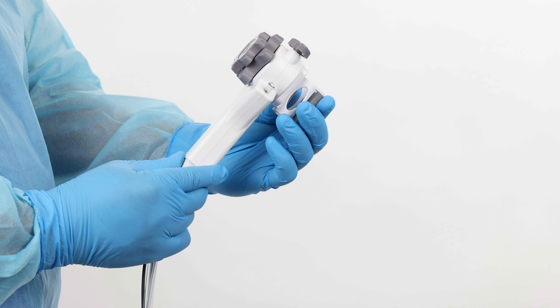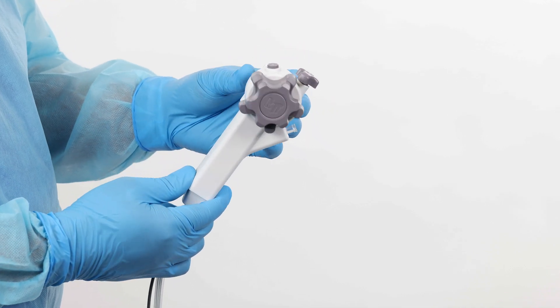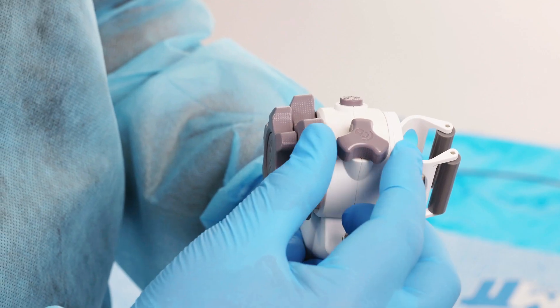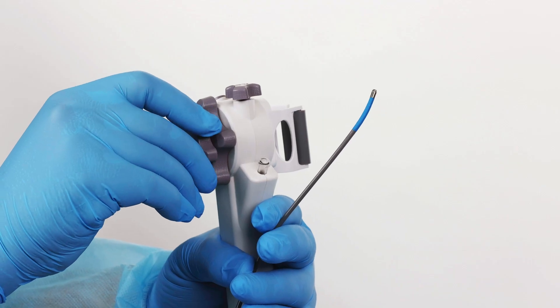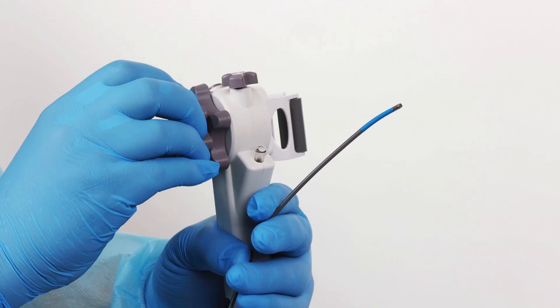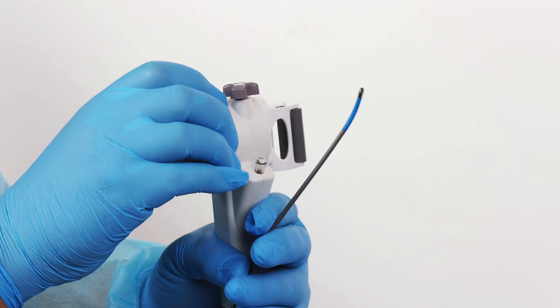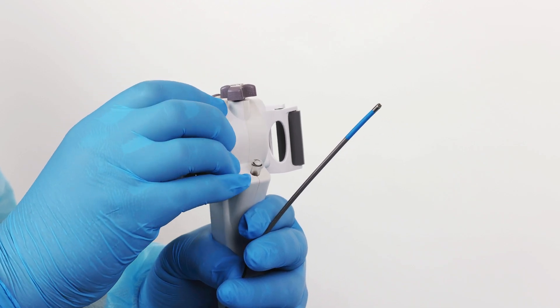Check the handle, working channel port, irrigation, and aspiration ports. Ensure there is no loosening or damage to any of the components. Ensure the articulation lock is released and gently turn the steering knobs on the handle. Confirm the articulation section moves smoothly and is stable. Do not straighten the articulation section by hand, as this may damage the control mechanism.